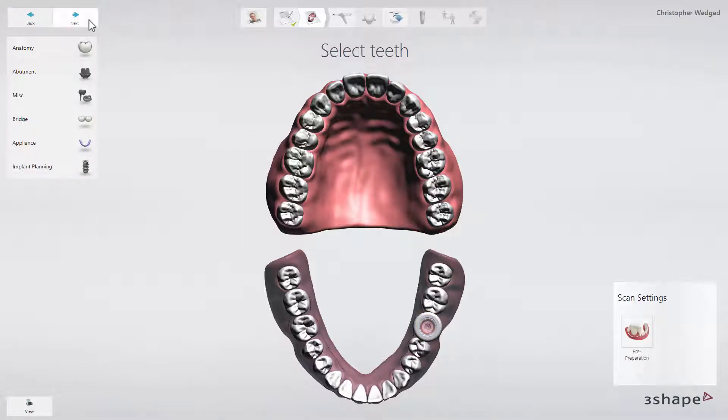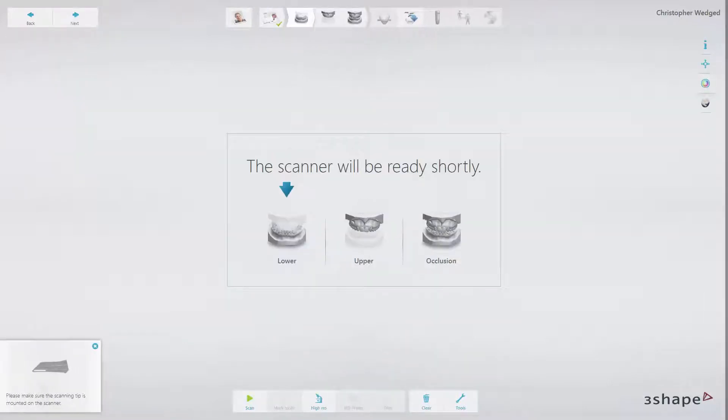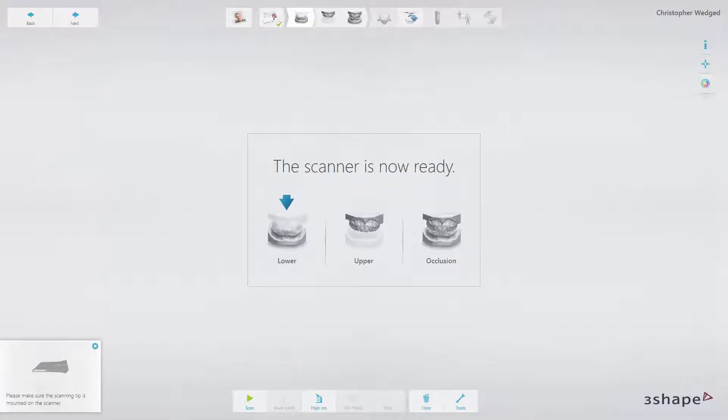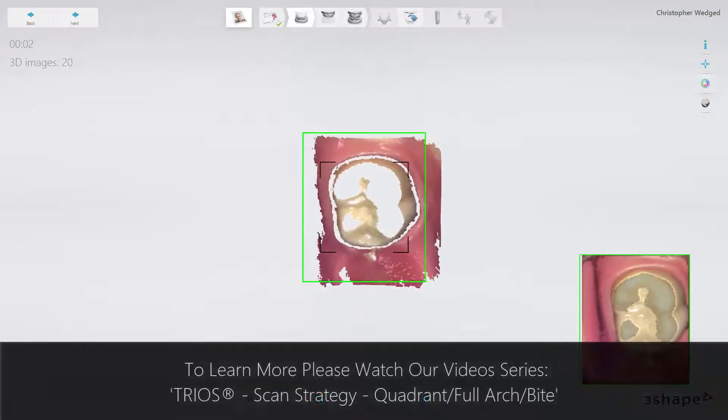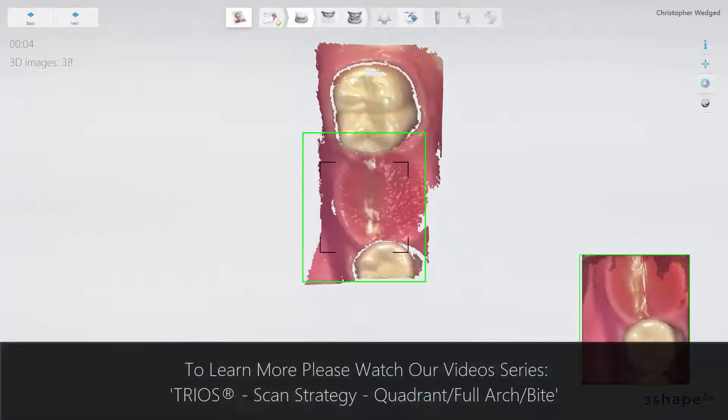Click next to go to the scan page. When scanning for a tooth-supported surgical guide, it's important to scan the teeth, but also the soft tissue in the region of interest — and not only the top surface of the crest, but all the way down on the sides. Start your scan from the occlusal on the most posterior tooth, following the official scan strategy.